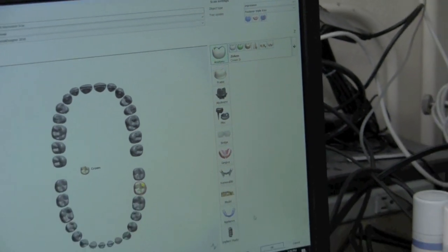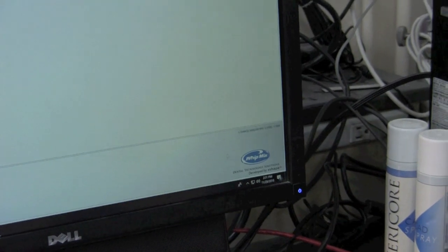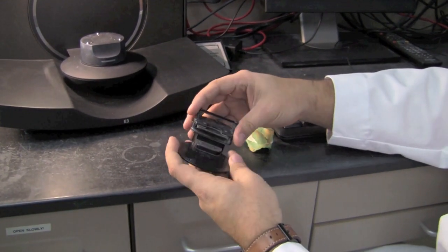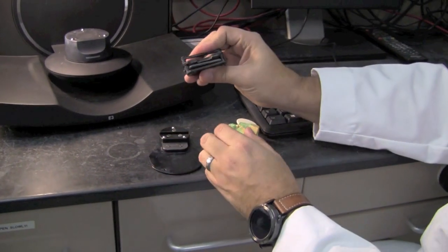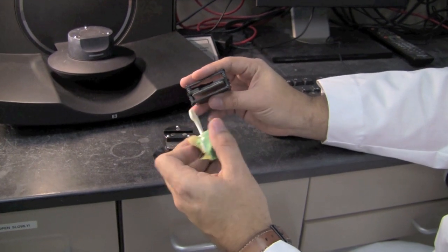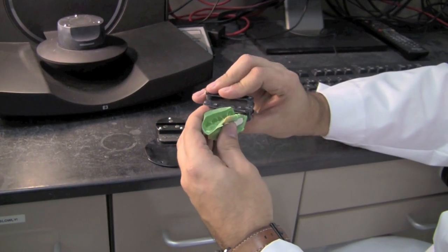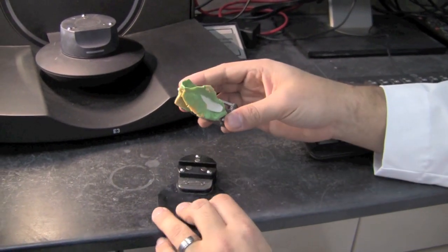I'm going to come down here to the bottom right and select Scan. This is the impression fixture provided by Three Shape — it's a two-piece fixture. The way this works is it's on a spring-loaded clamp, so you'll just take your impression here. You always want to go maxillary side up first when you scan, so we're going to go ahead and set this in here and let the spring-loaded clamp hold it in place so it doesn't move around.